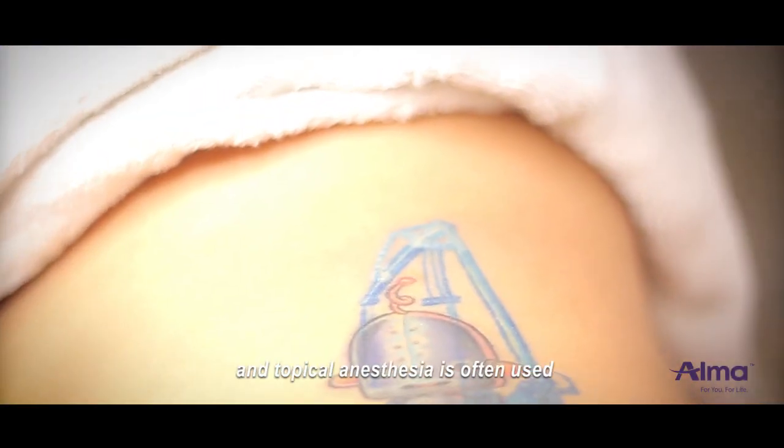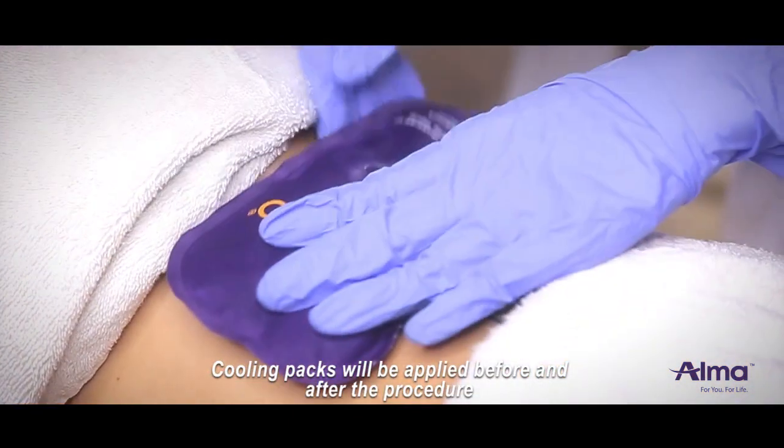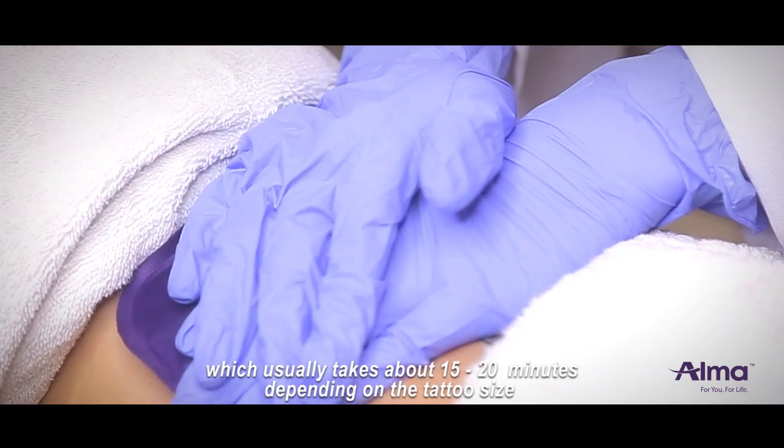Unfortunately, the procedure is not painless, and topical anesthesia is often used. Cooling packs will be applied before and after the procedure, which usually takes about 15 to 20 minutes depending on the tattoo size.